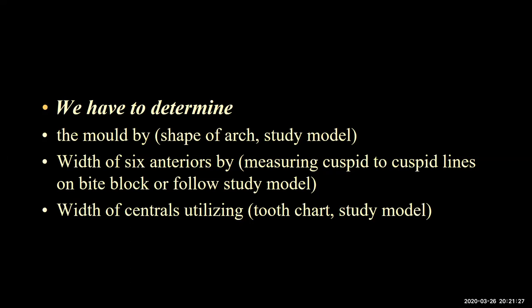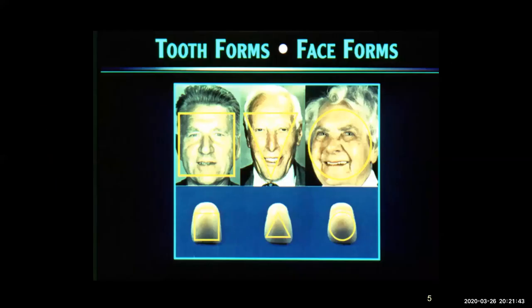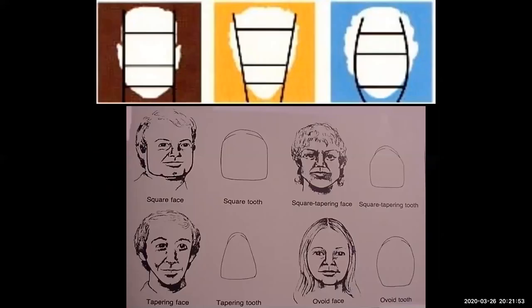And we have to determine the width of the six anteriors at times by measuring cuspid to cuspid on the occlusal rim. Then we go to the tooth chart, and it gives us guidelines to pick out those anterior and posterior teeth. Our concerns are the width of the six anteriors, the shape of the centrals, and of course, the shade. As I mentioned earlier, tooth forms equal facial forms. We have a square face here, a square tapering, an ovoid face, and then the teeth that correspond with it.